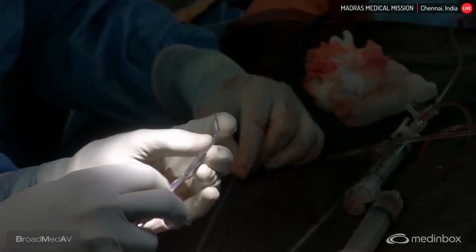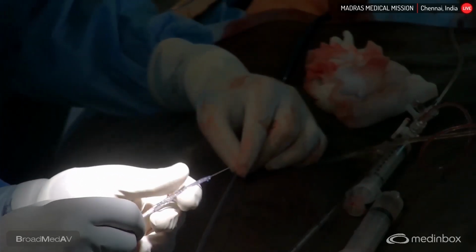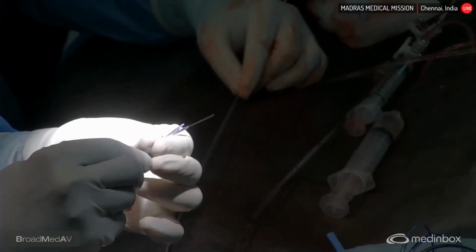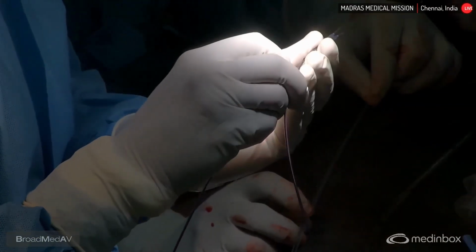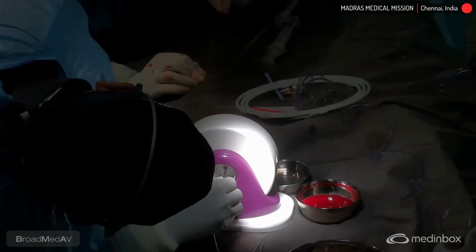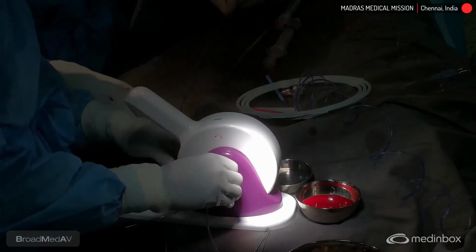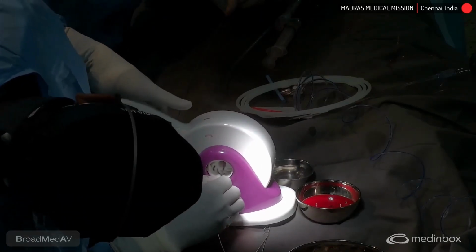This is a 26 millimeter stent, and so now we are crimping the stent now. Press it here.